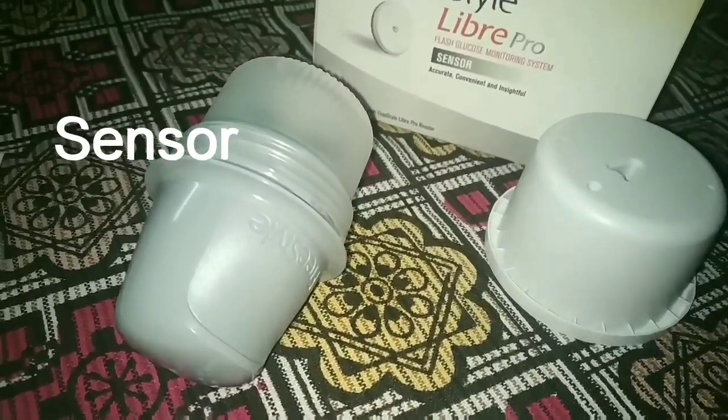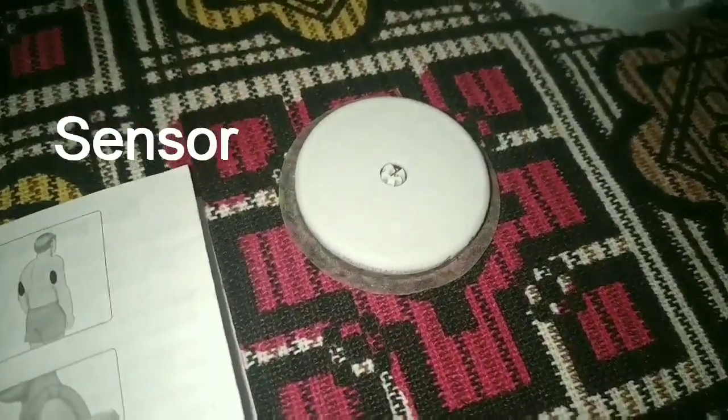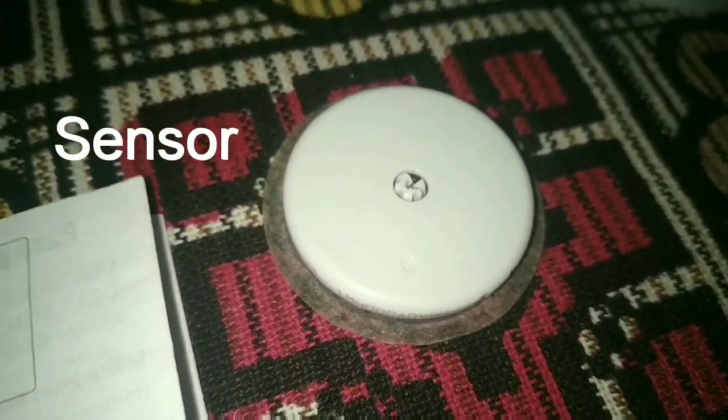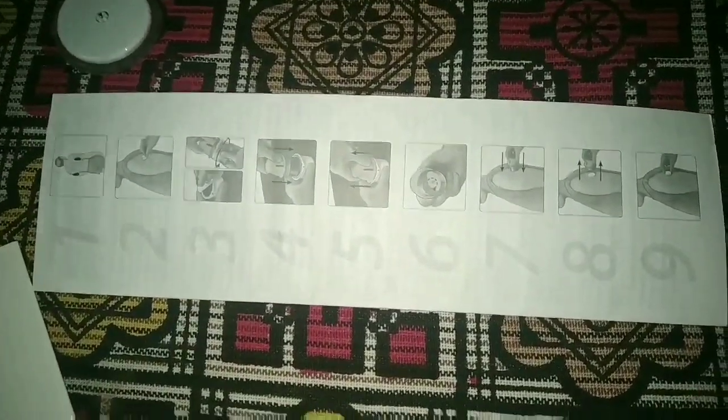This is the sensor box, which includes an applicator and a sensor. This is the sensor — just to display it. Also included is the user manual, which outlines nine steps to apply a sensor on the body.